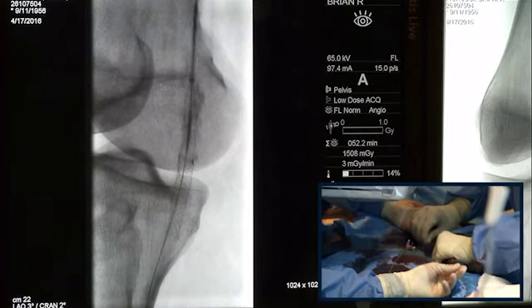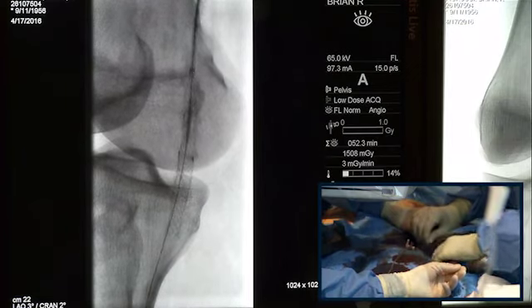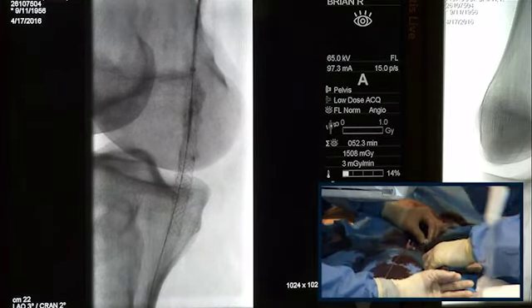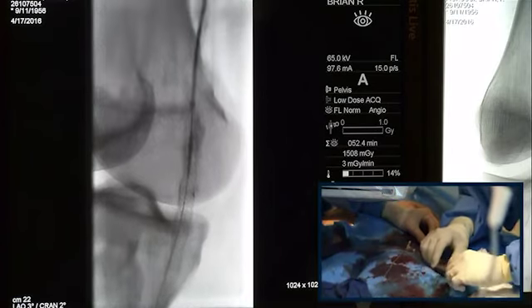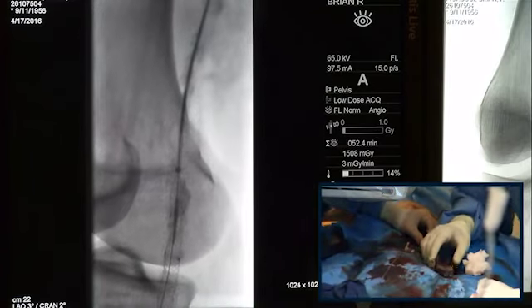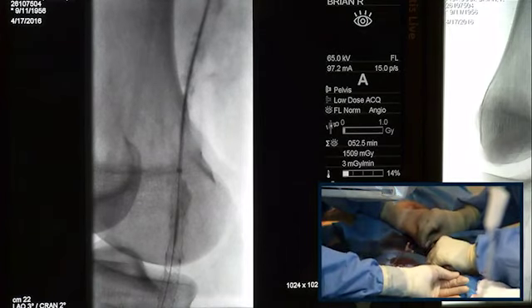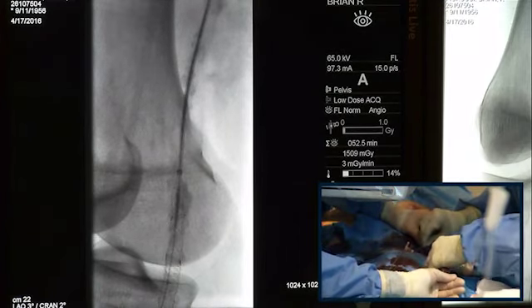I'm having a little bit of difficulty seeing it. It may just be the angle of my monitor right now. Is the calcium, no space? Craig? Okay. So pan up a little bit. But unlike other stents, you must really view this stent as you deploy it. And that's, I think, the other thing that became very obvious.